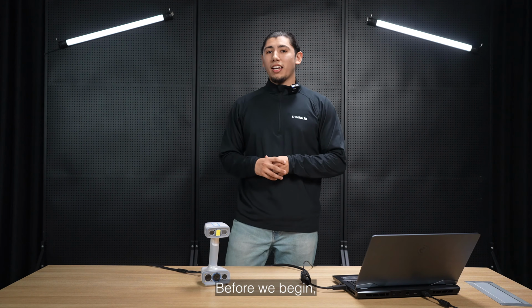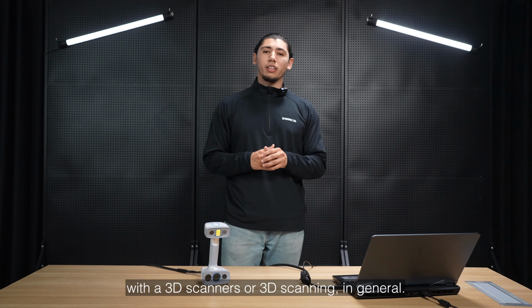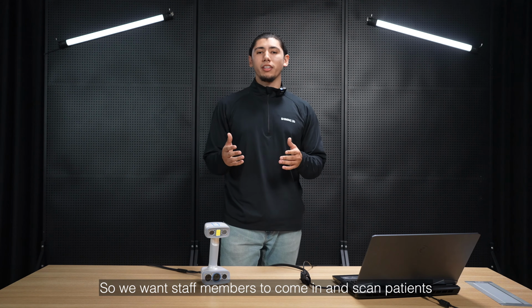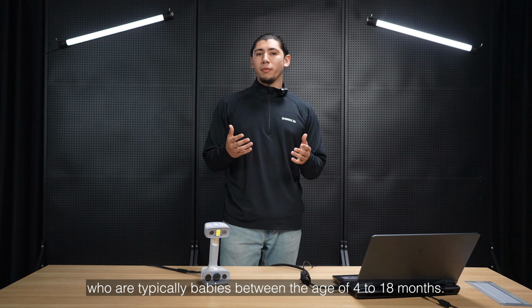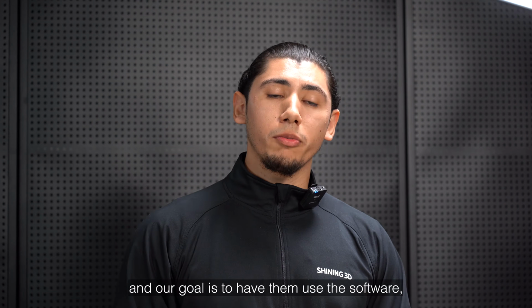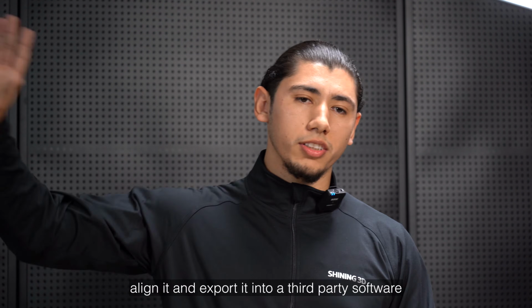Before we begin, I want to say that this software was designed to be used by users that have little to no scan experience with 3D scanners or 3D scanning in general. So we want staff members to come in and scan patients who are typically babies between the age of 4 to 18 months. They come in, and our goal is to have them use the software, collect the data as fast as possible, and quickly align it and export it into a third-party software.